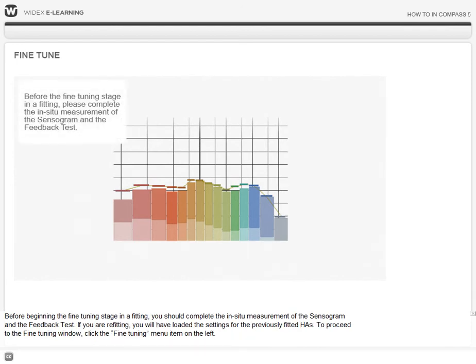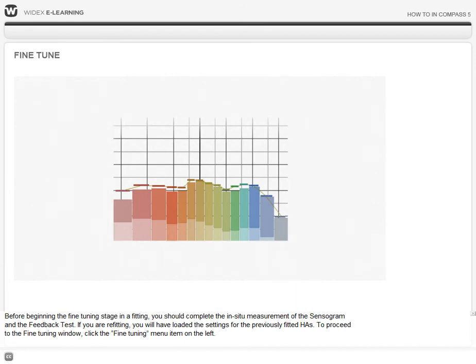Before beginning the fine-tuning stage in a fitting, you should complete the in-situ measurement of the sensorgram and the feedback test. If you are refitting, you will have loaded the settings for the previous fitted hearing aids.